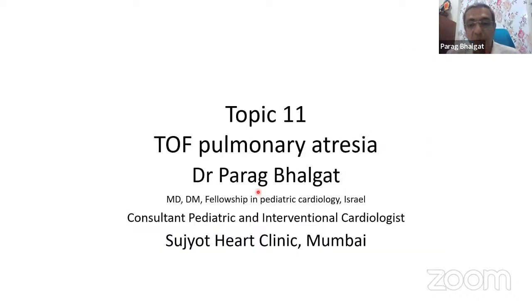Coming to the next topic, TOF with pulmonary atresia. It's a rare variant, not so rare, but it's an uncommon variety. It's one of the most severe forms of TOF.